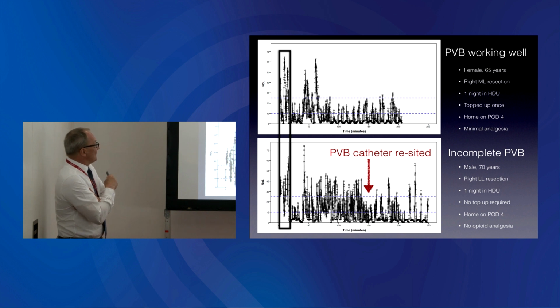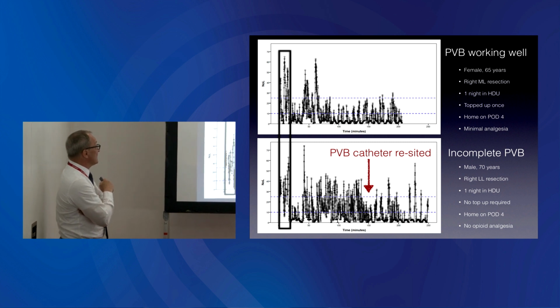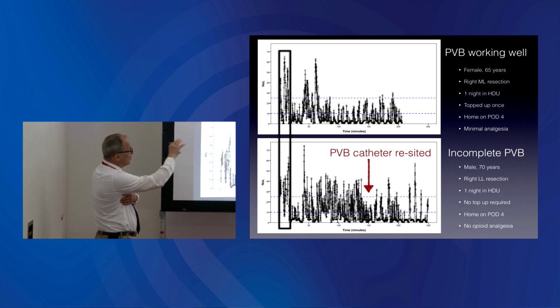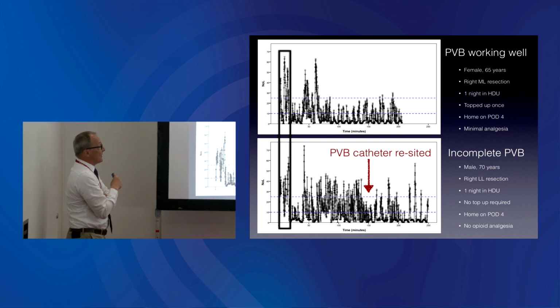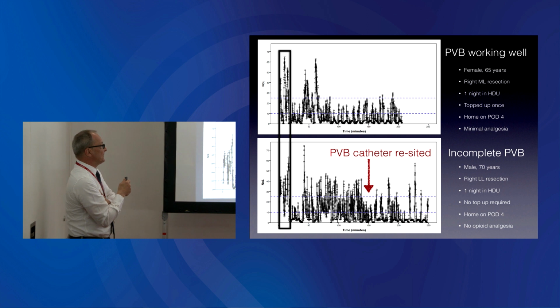That was the typical thing here, and the NOL demonstrates that this is happening. This is where surgery actually starts, and then we hope that the recordings get more stable, and that was in keeping with the hemodynamics and with pretty much all the other documentation of the patients.